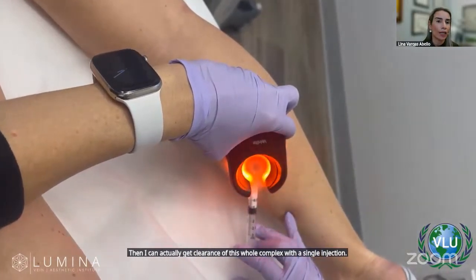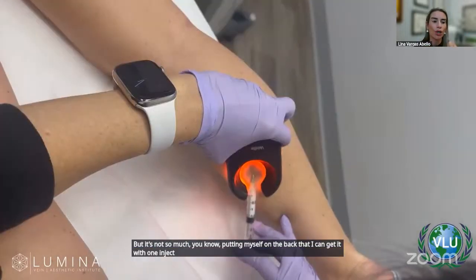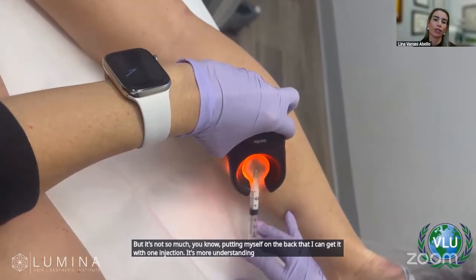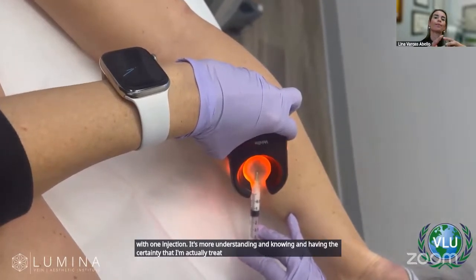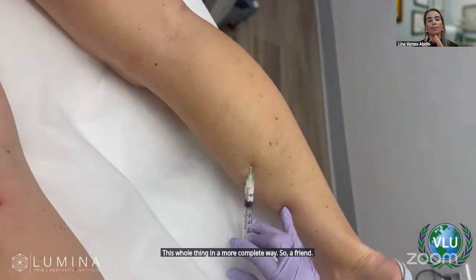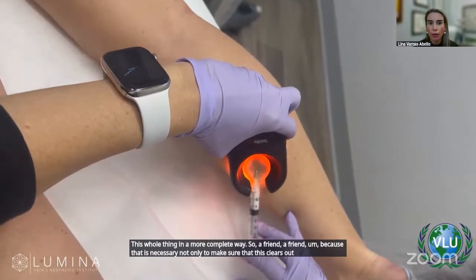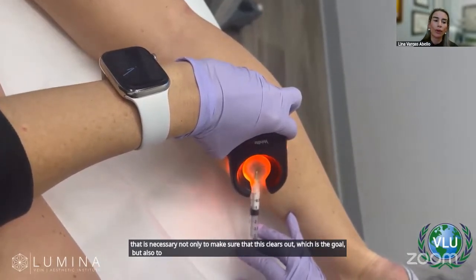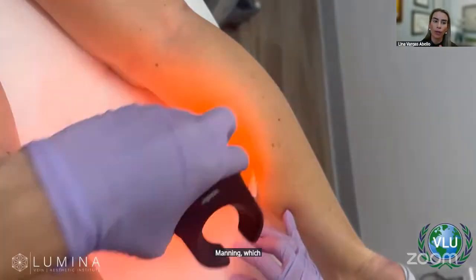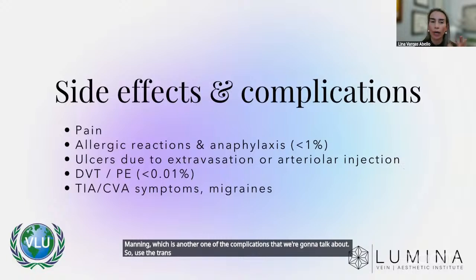But it's not so much patting myself on the back that I can get it with one injection. It's more understanding and having the certainty that I'm treating this whole thing in a more complete way. So afferent, efferent, because that is necessary not only to make sure that this clears out, which is the goal, but also to do it without matting, which is another one of the complications that we're going to talk about. So use transillumination, whatever system you have available, they all work. I just personally use this one, works for me.